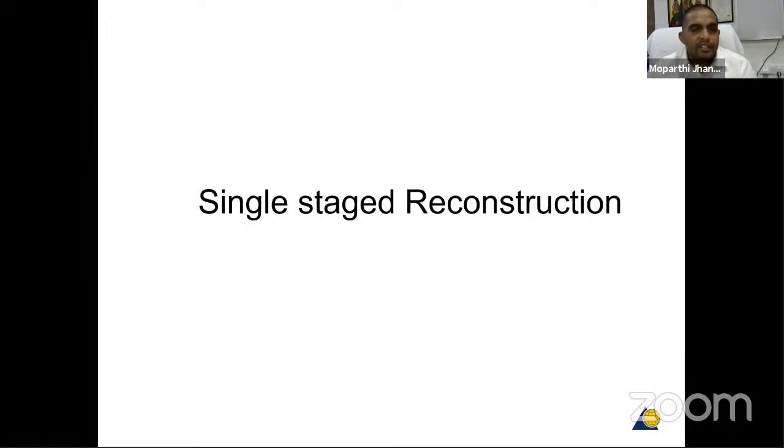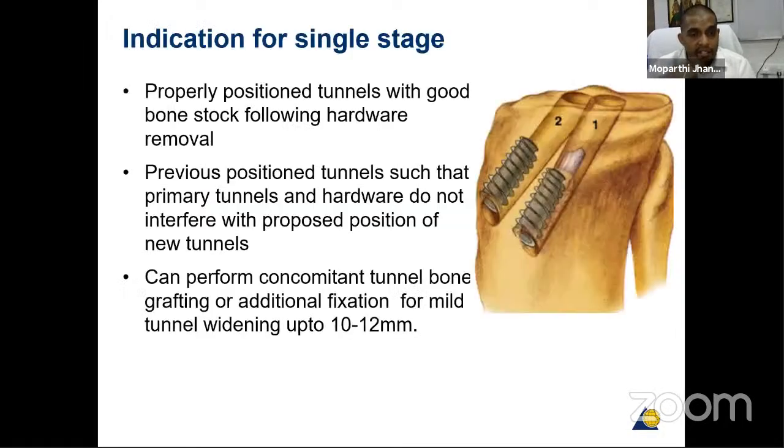Single stage reconstruction indications. A properly positioned tunnel with good bone stock is one thing. The tunnel should not be widened more than 10 mm. In those conditions we can use it, but there should not be any adjacent lysis. So remove the hardware. The previously positioned tunnel, you can close it off, or you can go for the other tunnel.